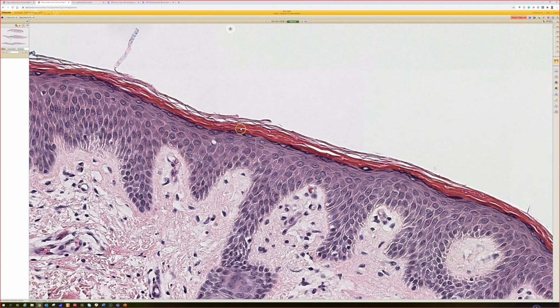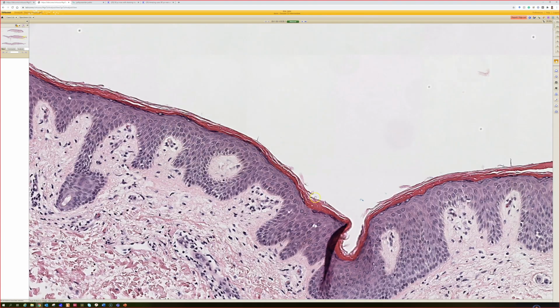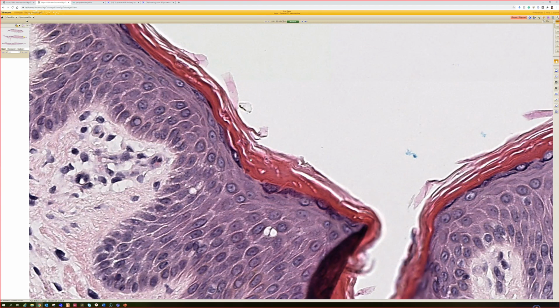So what other things, aside from compact ortho or maybe a sandwich sign, what other things can make you think of dermatophyte? Just like the normal skin differential. If you're just struggling, like nothing jumps out at you. That's true. But there's one other thing. If I see spongiotic dermatitis with one extra finding, does anyone know what thing will, at least for me, prompt me usually to do a PAS?